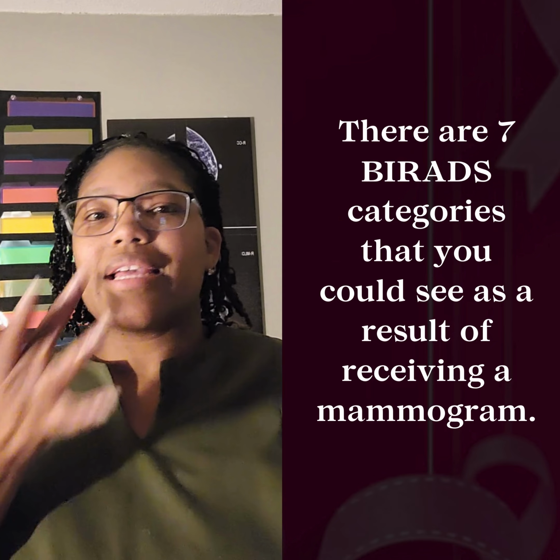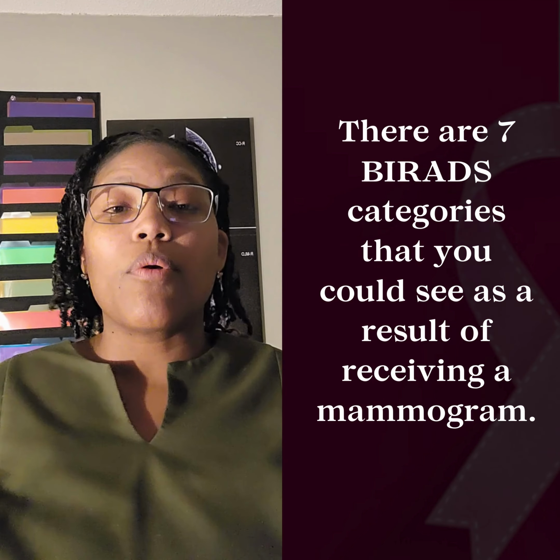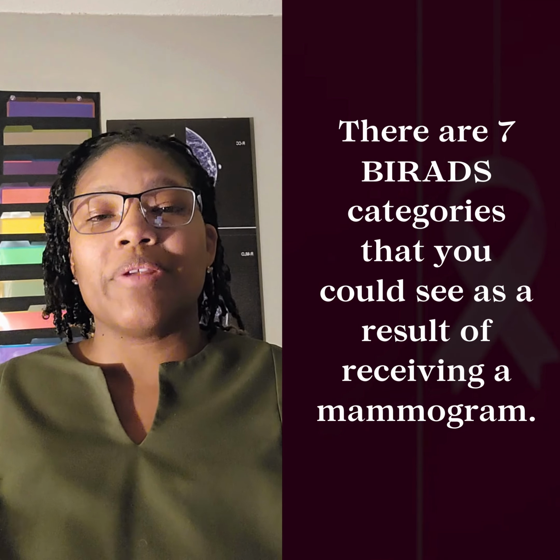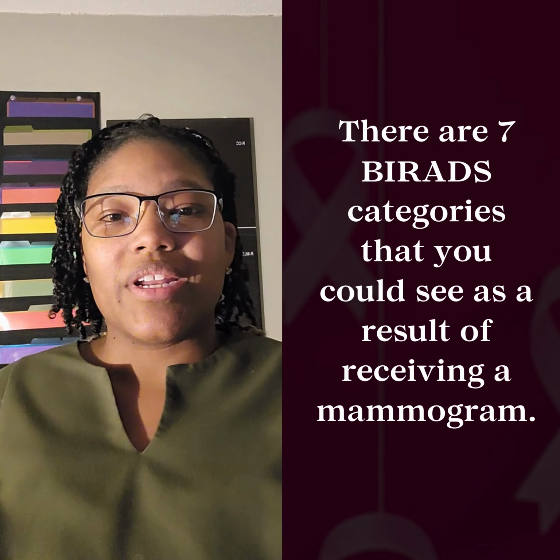On the tech side, we have what we call BI-RADS categories. BI-RADS is a reporting system for the radiologist to communicate with the doctors, stating what additional steps will be taken after your screening mammogram.